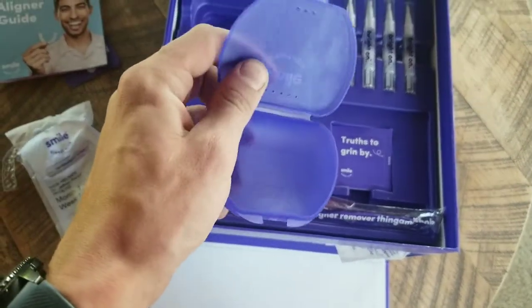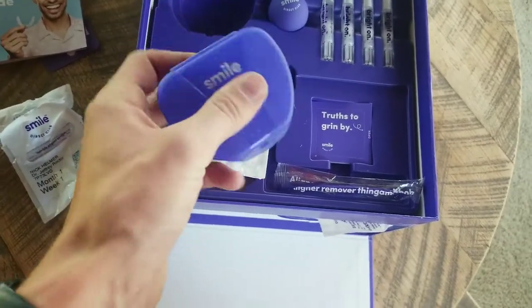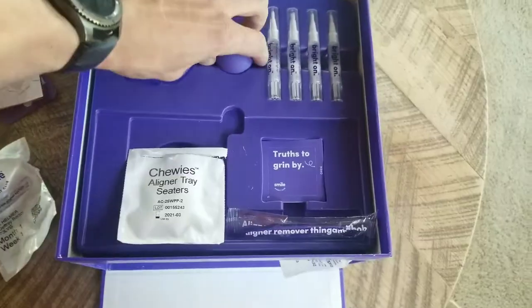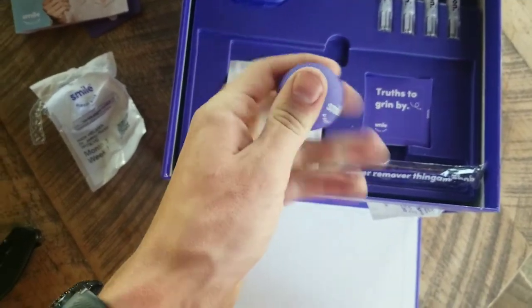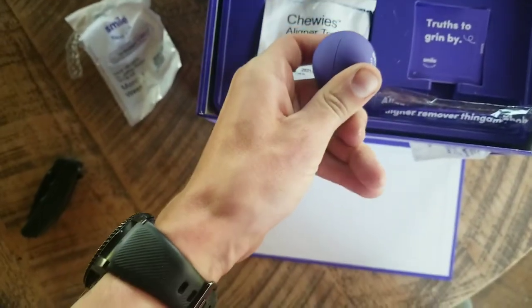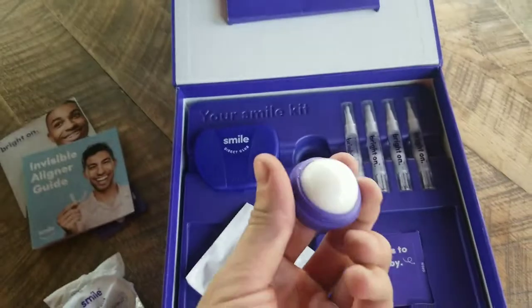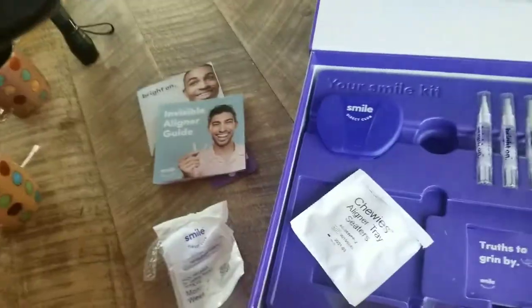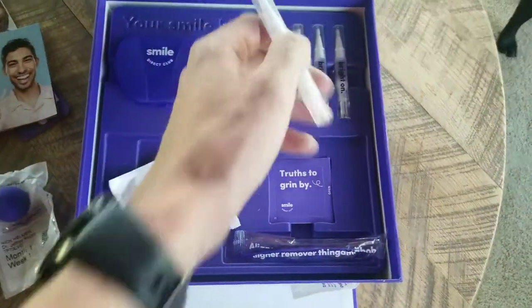This is your basic plastic case — it's actually kind of durable plastic, it's really not that bad. You get your lip balm — let's see if I can do this one-handed. Just your standard circle lip balm. And then you get your whitening pens.